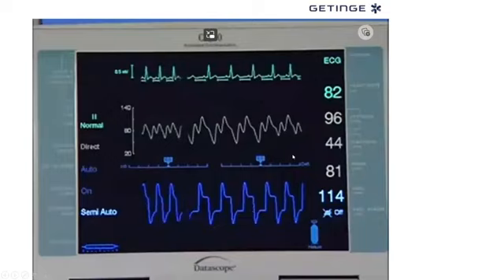And here is an illustration showing you in the same patient when he goes from a slower to a faster rhythm, how by EKG, it will adjust the timing of deflation at the peak of R in response to the change of cardiac rhythm. It automatically deflates appropriately if you become faster because it reads the EKG on a beat-to-beat fashion.